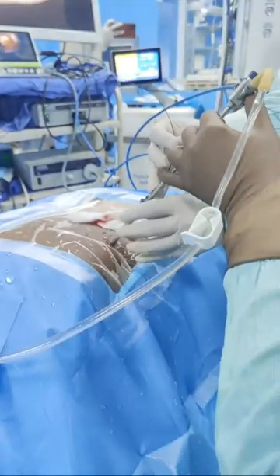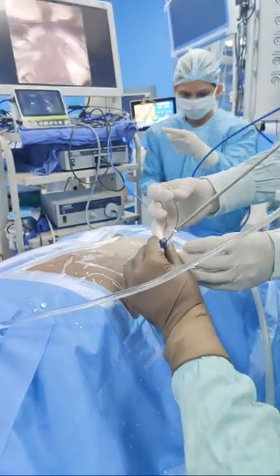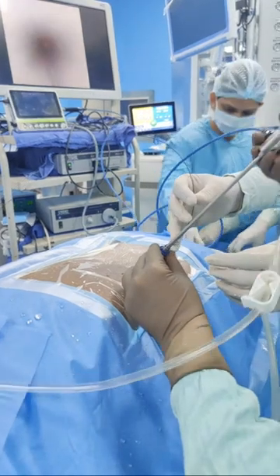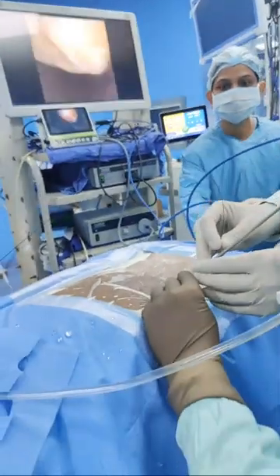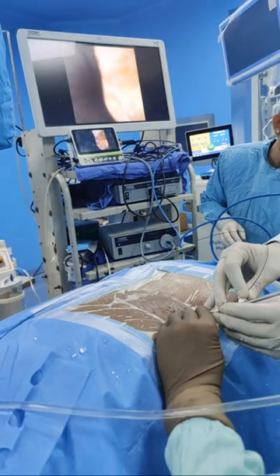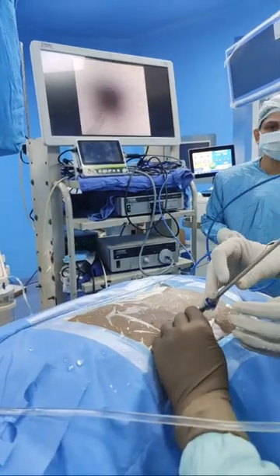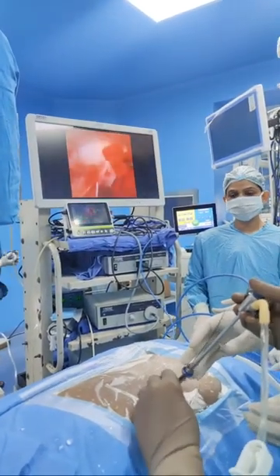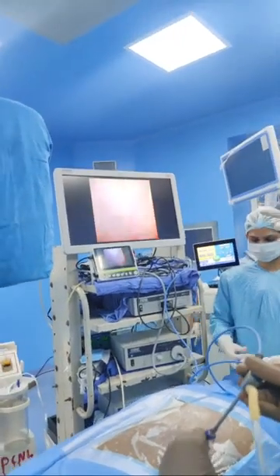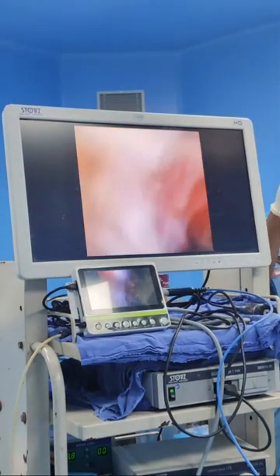Coming out. Very good. Is suction on? Yes. Okay. Start. Okay. It has gone back. If you put the suction in. No. Suction on. Okay. Let's see whether it comes out. It has fallen. Good. Wonderful. Oh, so that's another trick, how you remove the stone, right? So now we will try to go inside the track. Yes. So now we are in, and we can see the biggest stone. Okay, we'll go back.